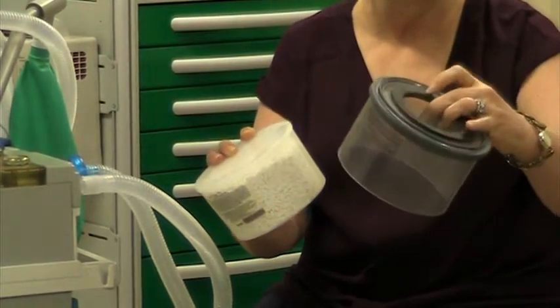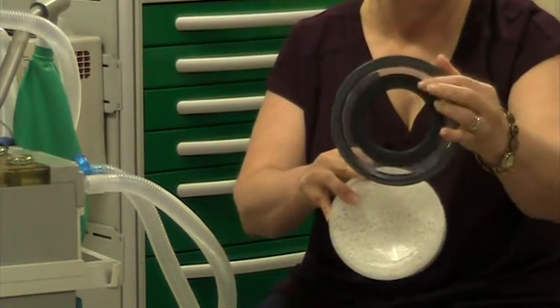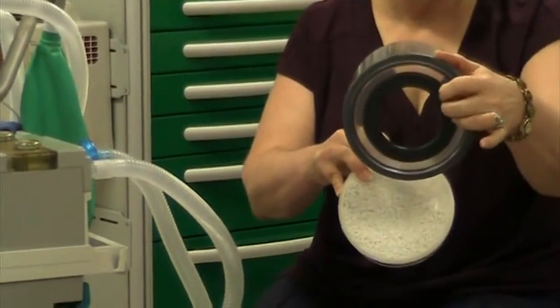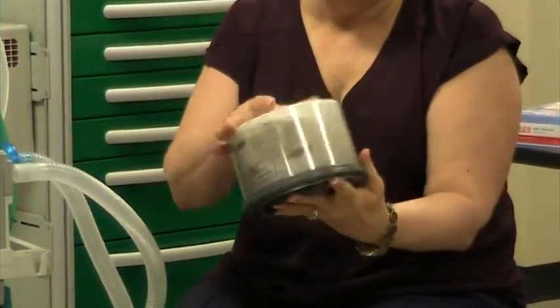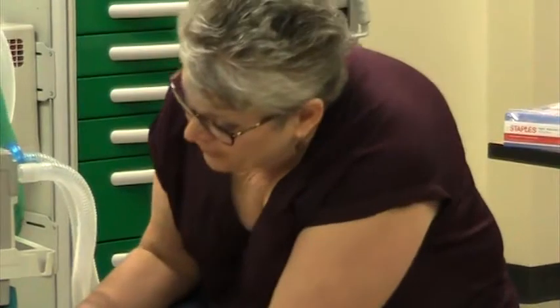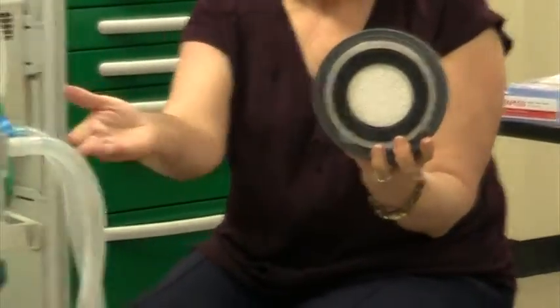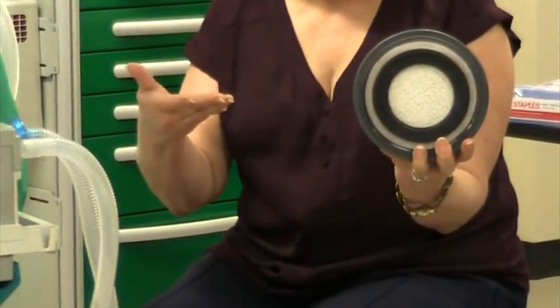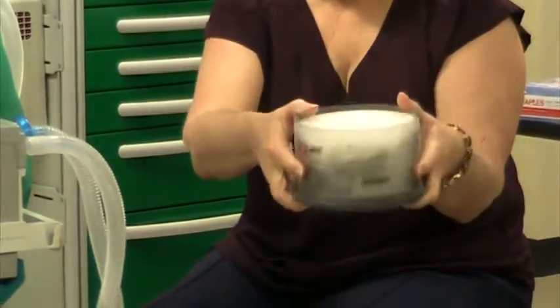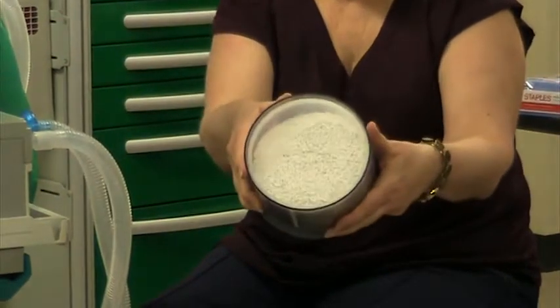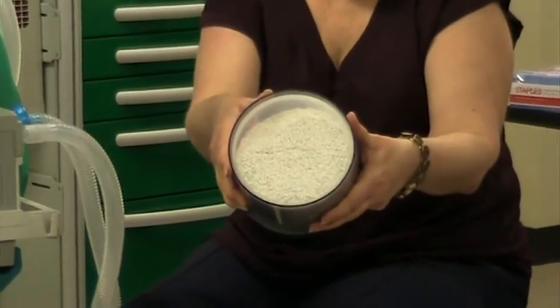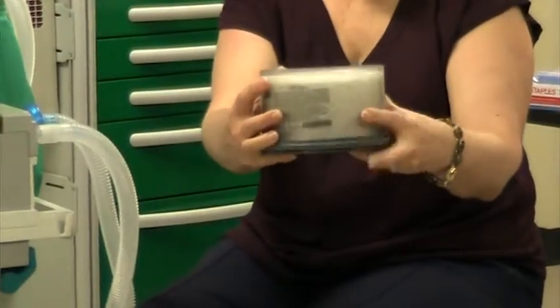On the bottom here you can see there is a sealing ring, a rubber ring, so that you get a full seal when you put this in the machine. You can also see there is an open space here, so as the exhaled air comes through, it comes up and meets all the four to eight mesh of the carbon dioxide absorbent granules.